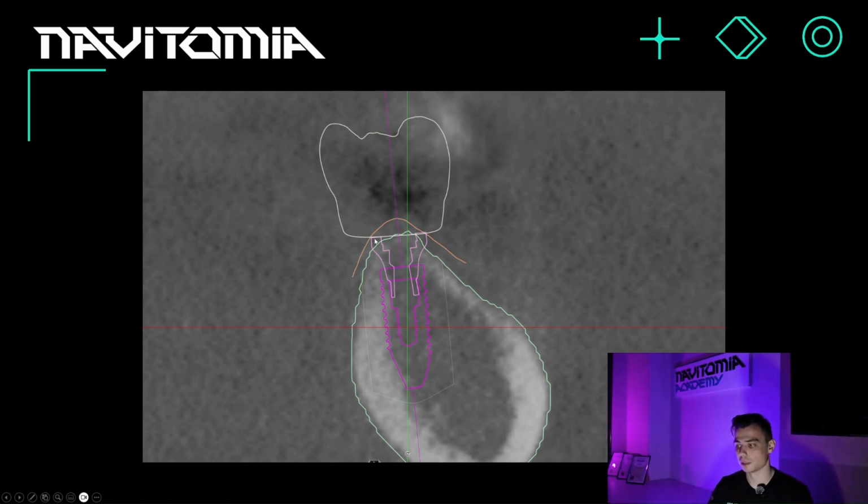And the second point is that the superstructure is, you could say, located beneath the gum. Yes, as surgeons, we will have to create a bone collar, that is a space in the bone for this superstructure so that it can fit in there, because as you can see, it is wider than the implant itself. But nevertheless, it's worth it, believe me.